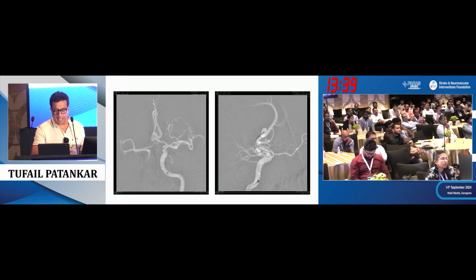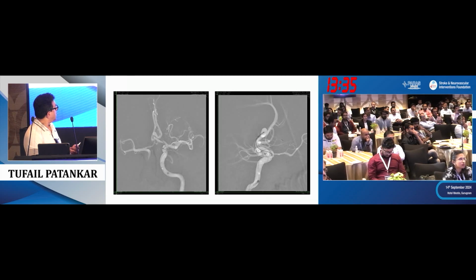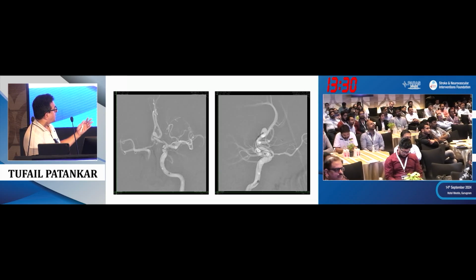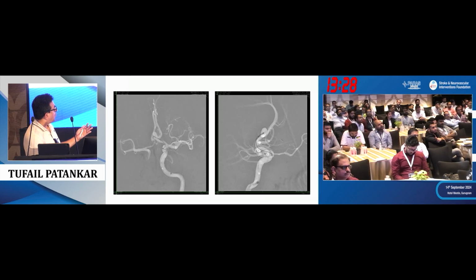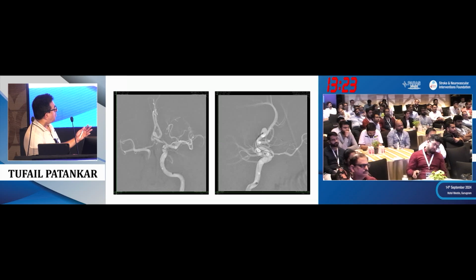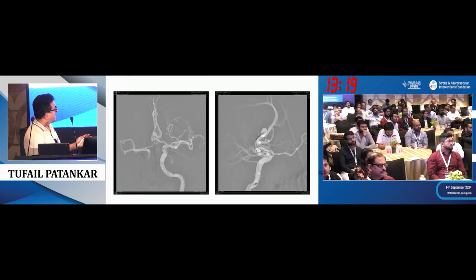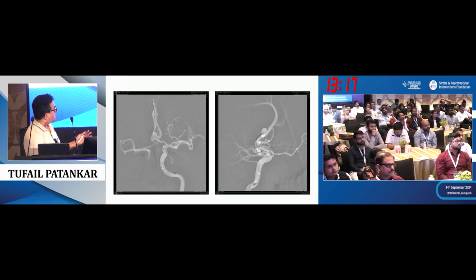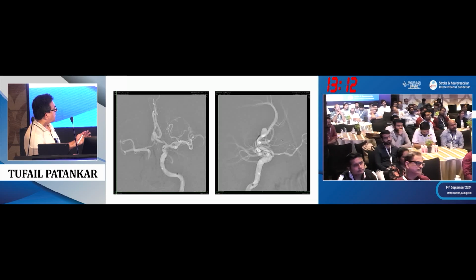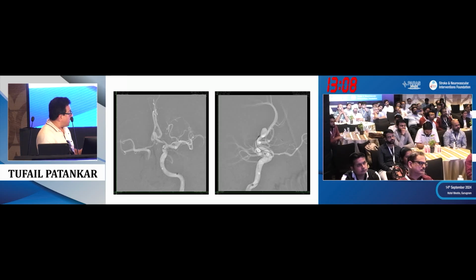And then you can see again now the device is being placed. As you can see now, you know that in this position you're going to be coming. Here you can see that I'm hitting the wall here. I'm going to try and now push the device. The device is touching the wall, as you can see in this projection. The catheter is going to self-center. I'm going to push it out. As you can see, the device is now getting pushed. You'll come down, and then you can reposition, you can manipulate a bit.